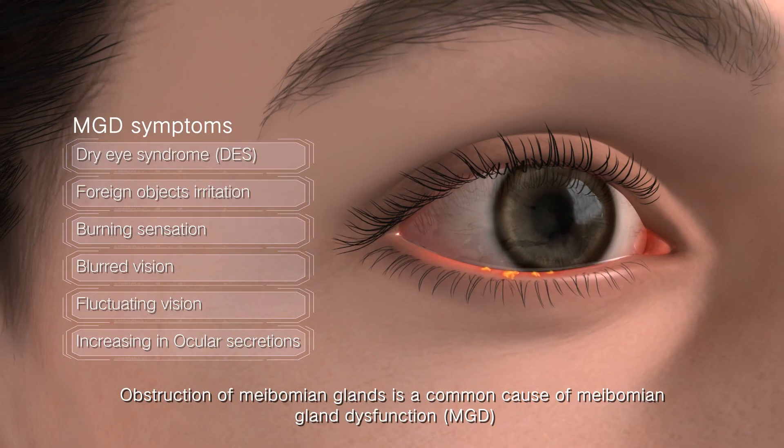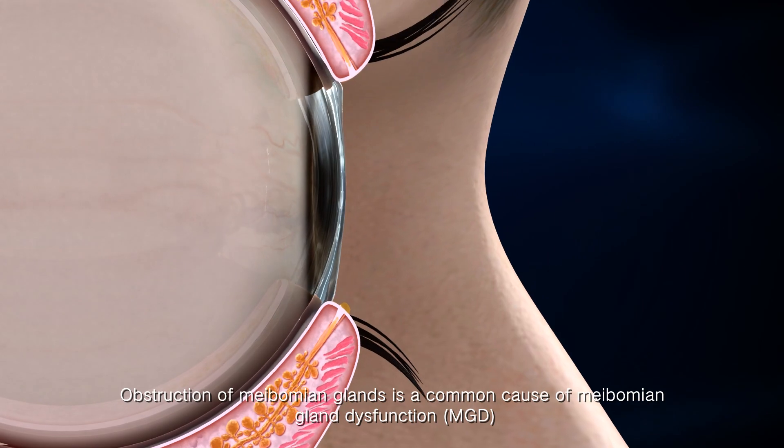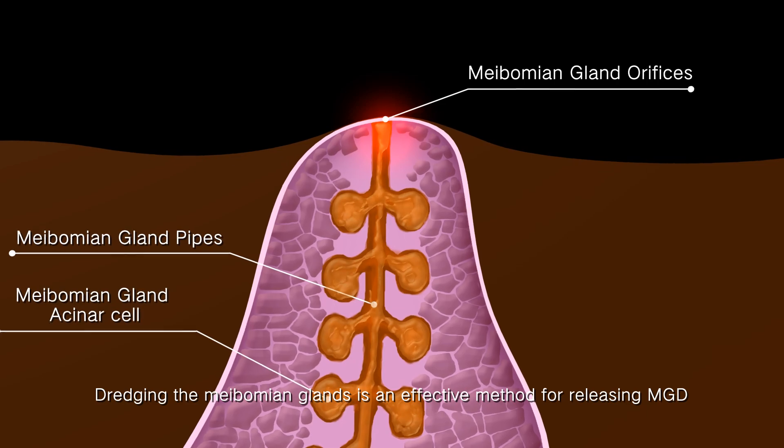Obstruction of Meibomian glands is a common cause of Meibomian gland dysfunction (MGD). Dredging the Meibomian glands is an effective method for releasing MGD.